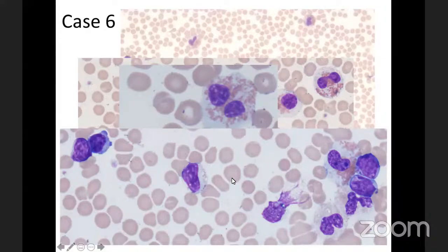So you need your immunophenotyping, definitely. This is a case of acute leukemia. We have more than 20% circulating blasts in the peripheral blood. So you would recommend a bone marrow examination, immunophenotyping, and a full cytogenetic and molecular study for this patient. Morphology is not enough these days.